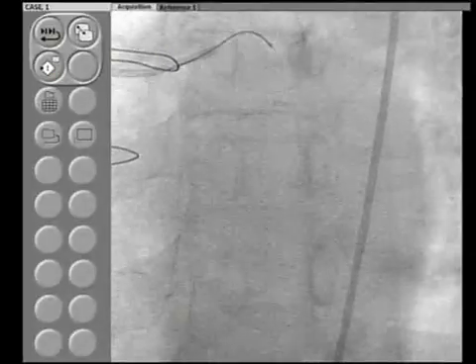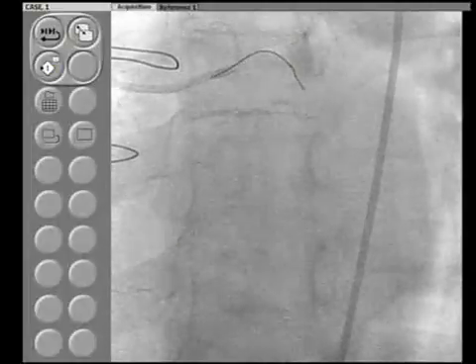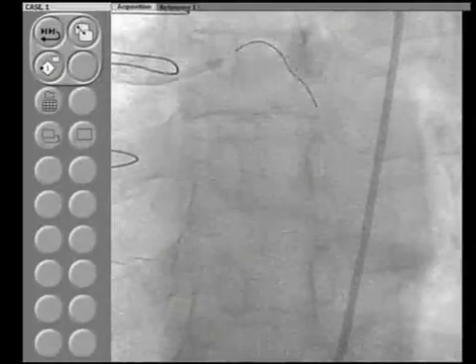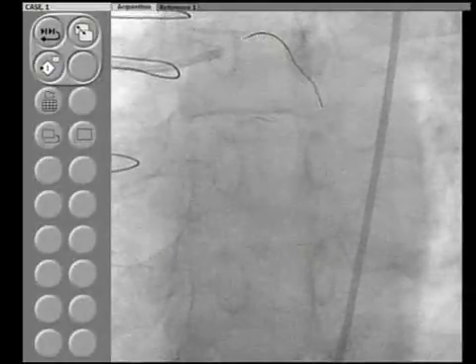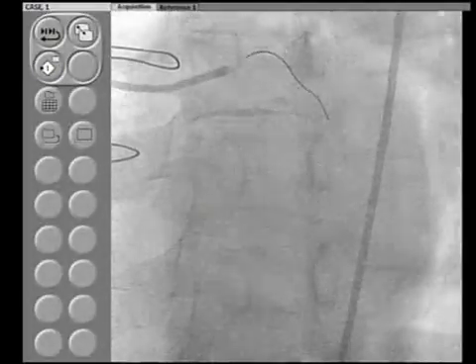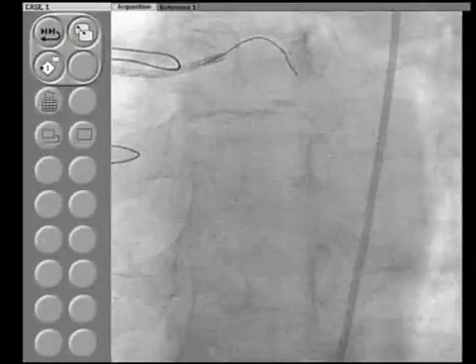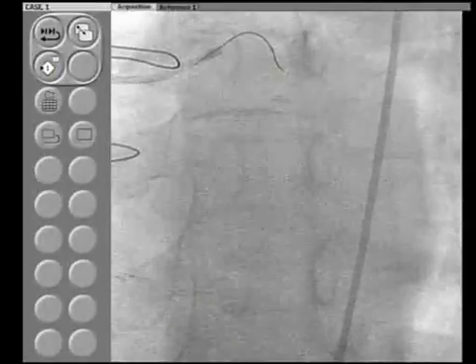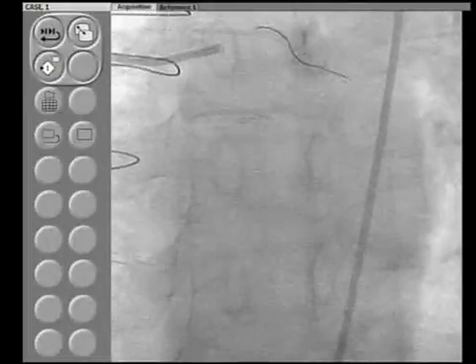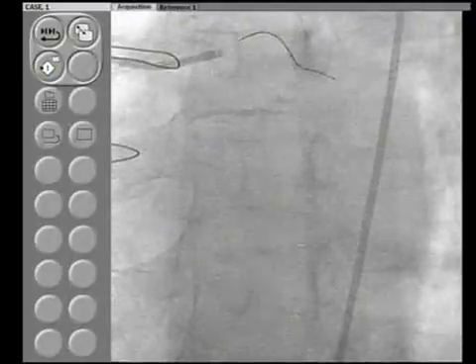Now this is our Fine Cross after taking the venture out. Remember, you have to pull it back proximally. Ready? Now we need to make a little better curve. See, we have brought it proximally. Therefore now after the venture is out, we have used the exchange length wire, a little dye. So now basically we need to go to the lower branch, and this is where it is. Now you want to advance. So now we have Fine Cross brought to the ostium of that bifurcating OM.